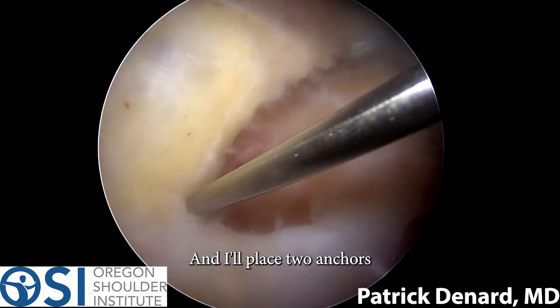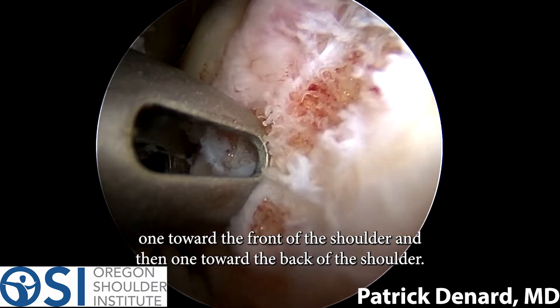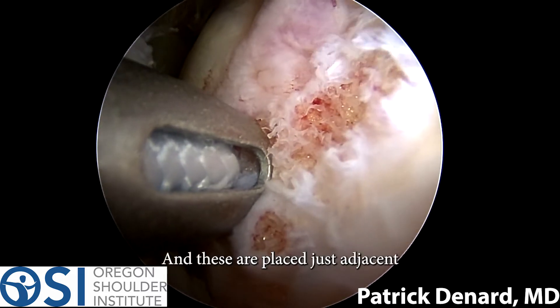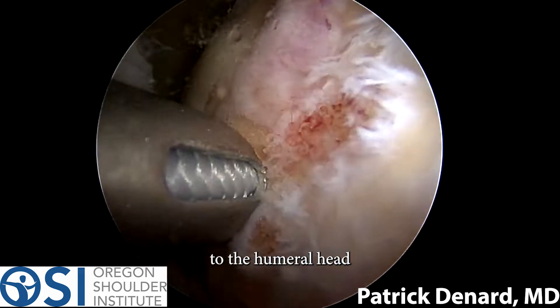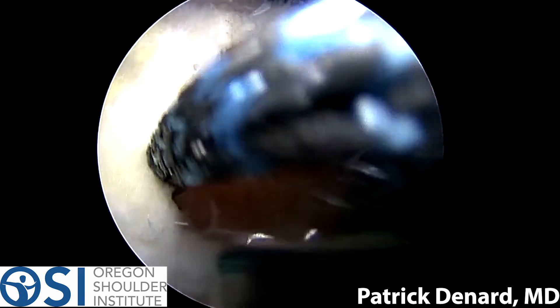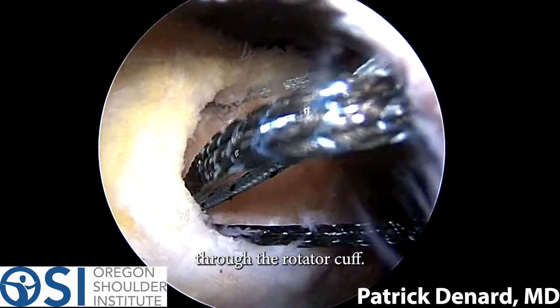I'll place two anchors — one toward the front of the shoulder and one toward the back of the shoulder. These are placed just adjacent to the humeral head and at the edges of the rotator cuff tear. These anchors have sutures on them that can be passed through the rotator cuff.